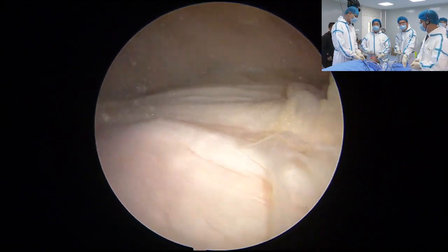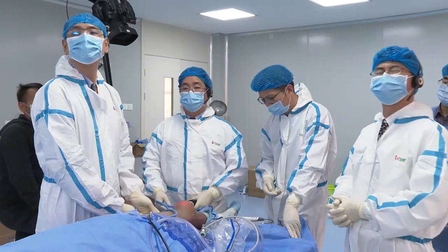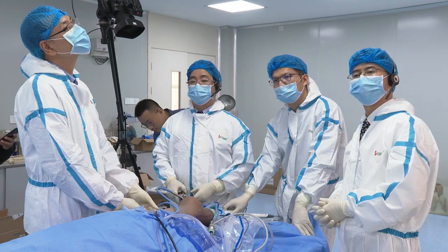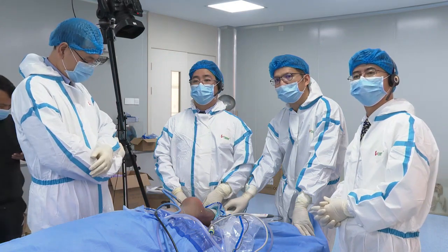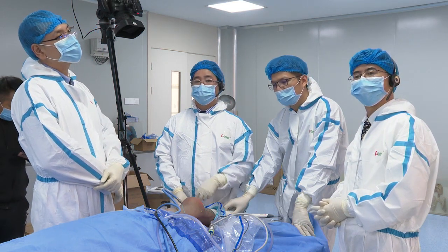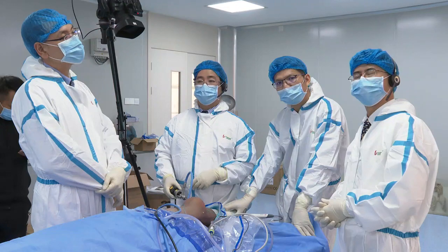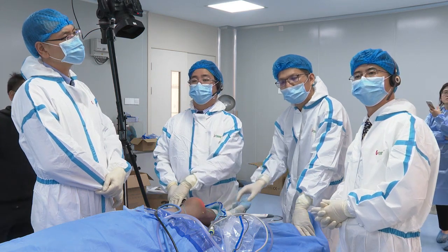Okay, Dr. Bancha. Yes. Thank you for your nice presentation. So I have a question. You know, you made the tunnel, whatever in the femur or tibia, all 9 millimeters. Is that so? Yeah. Right. So, because we made the graft often, for example, one end is 9 millimeters, another end is 7 millimeters. So always, according to my opinion, you can make maybe a 9 millimeter femoral tunnel and a 7 millimeter tibial tunnel. And in your condition, you have to make the same size tunnel, all 9 millimeters, you know.